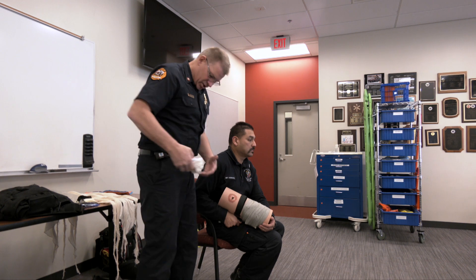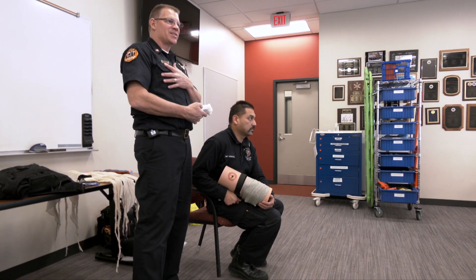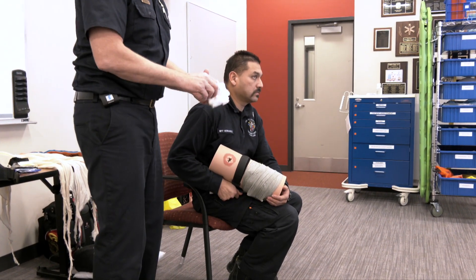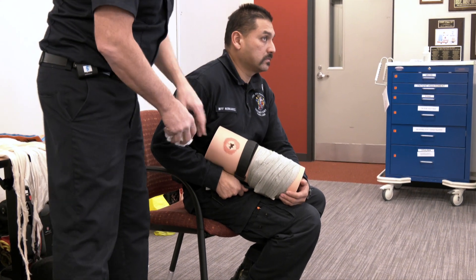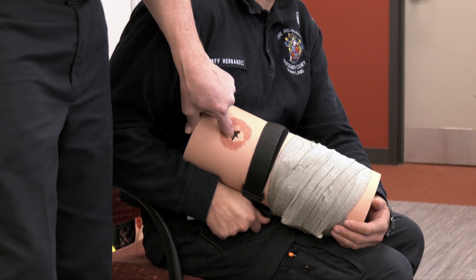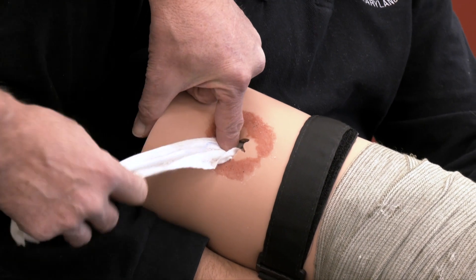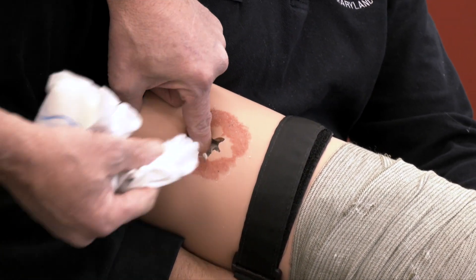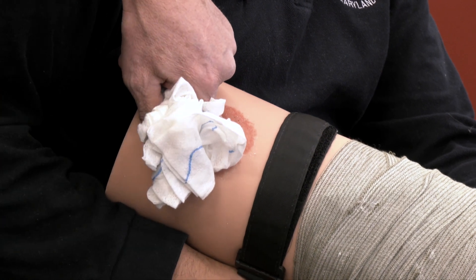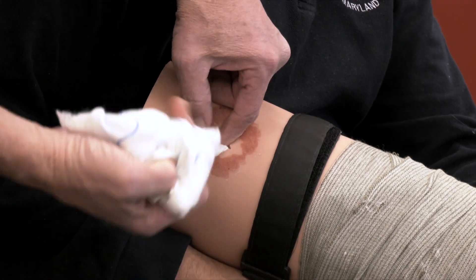The idea here is we have a large wound in a juncture. We're not going to pack the thoracic cavity — we're going to seal the cavity. We're going to pack the junctures and tourniquet the extremities — that's how we remember this. With a juncture wound, we reach in with our gloved hand, put pressure on the vessel that is leaking, then take the gauze and pack it right down against that vessel, packing outward from wherever that vessel is. Continue packing until the bleeding is controlled.